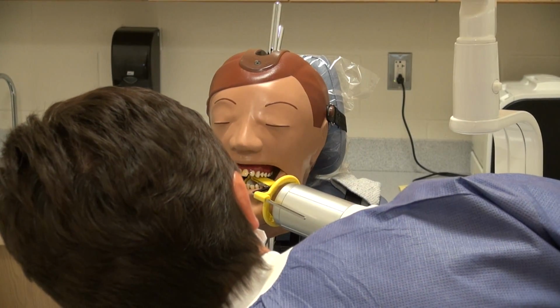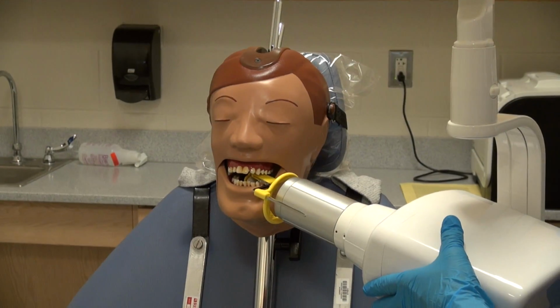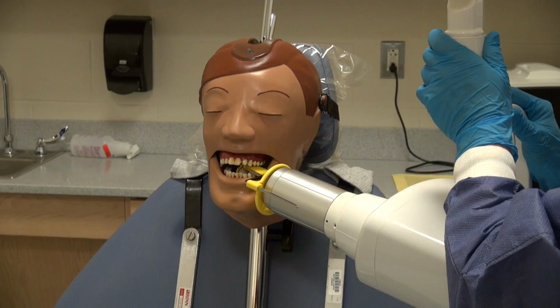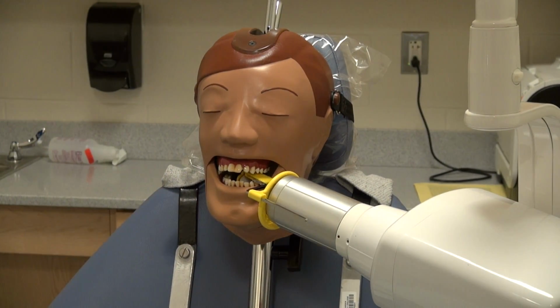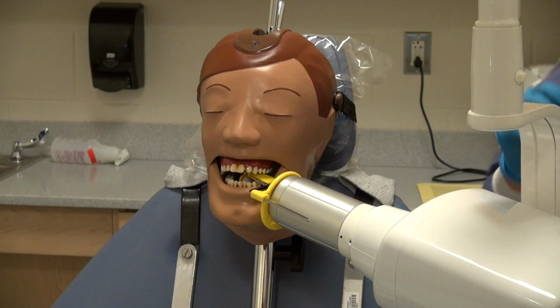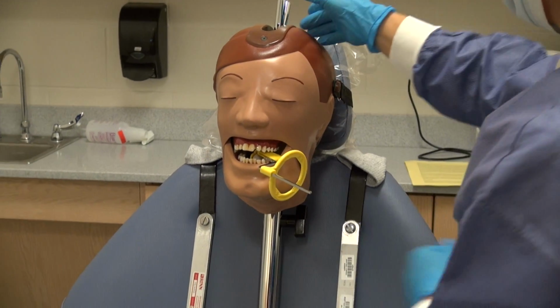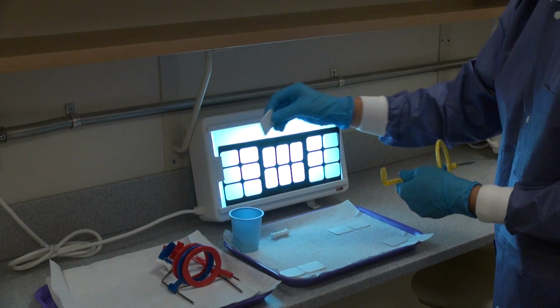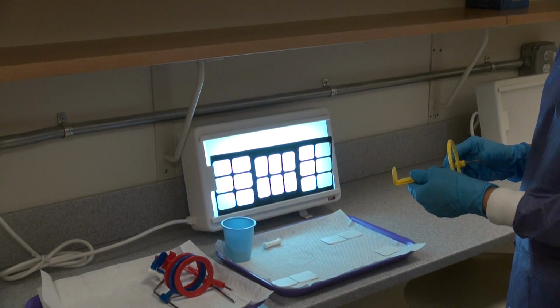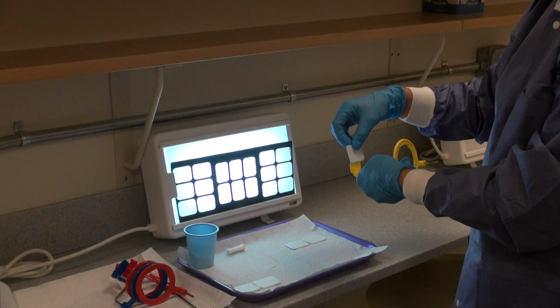and bring to the ring. The operator will exit and press the exposure button and quickly go in and remove the film from the patient's mouth when finished. Place the exposed film in the disposable cup on the tray and pick up the next film, which is the left mandibular molar periapical.